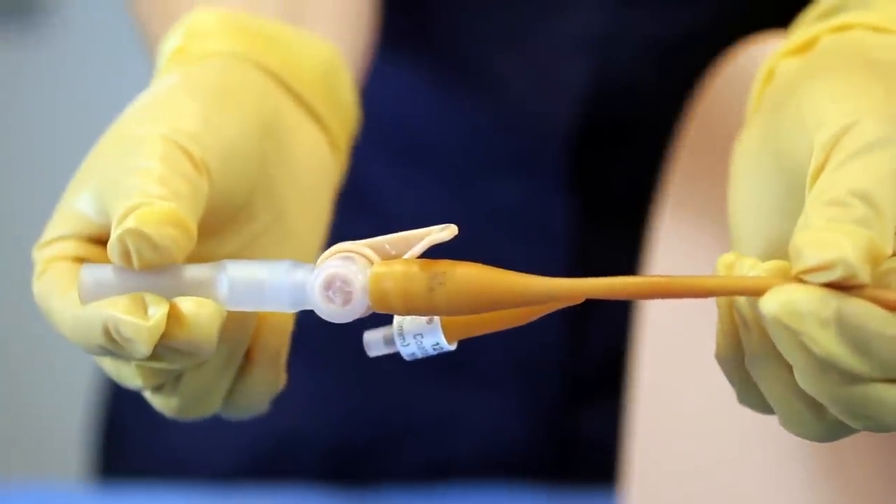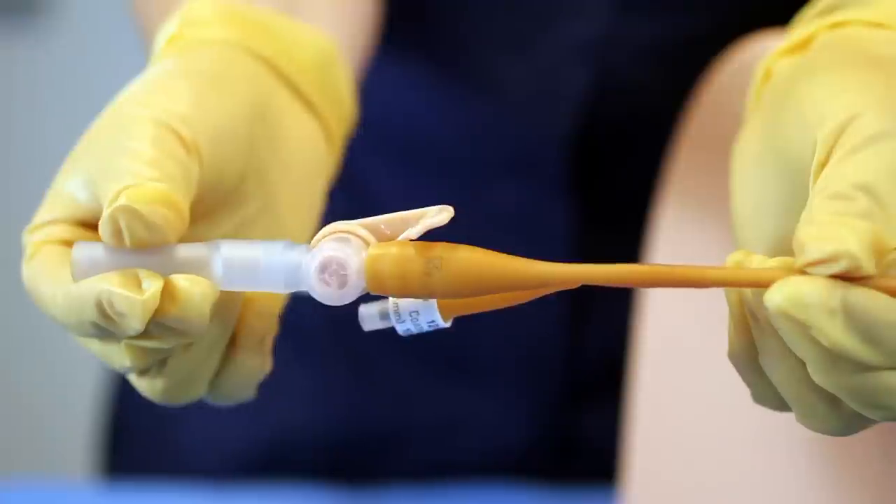The step connector creates a secure, firm and leak free connection, providing peace of mind.